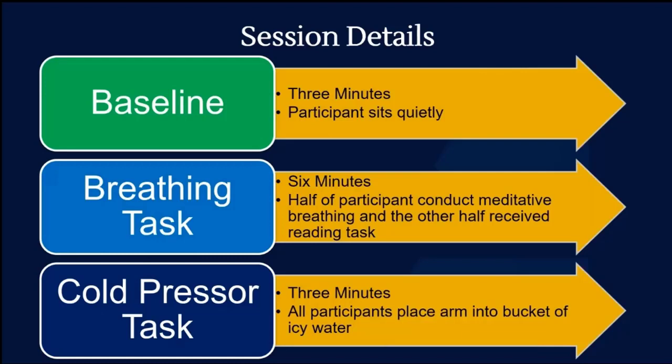And what is their basal high frequency heart rate variability? What do we see before we even try to induce any stress condition? This is helpful so that, when we're looking at these tasks and conditions that we are hypothesizing or inducing stress, we're able to offset the difference between participants. We can see their baseline information and compare that to the condition. And then that offset enables us to really compare across different participants, so for a between subject analysis. And so the baseline is very important in these senses.